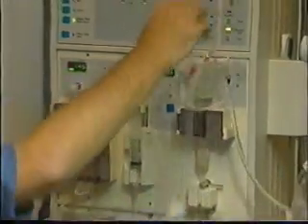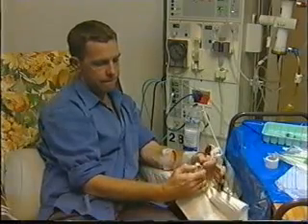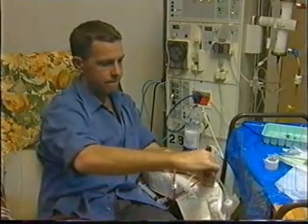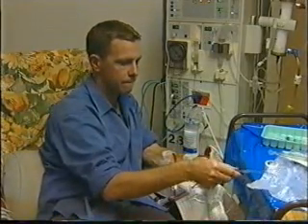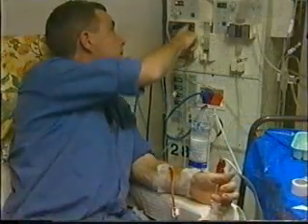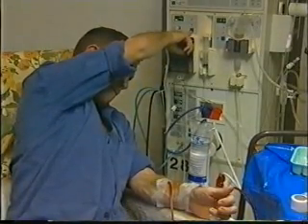Dialysis is often done in hospitals 3 times a week, lasting 4 or maybe 5 hours. It may be on Monday, Wednesday and Friday, or Tuesday, Thursday and Saturday. Mr. Harding does it every day, but only for 2 hours after he's finished his work. Dialysis is done exactly the same way for men and for women.